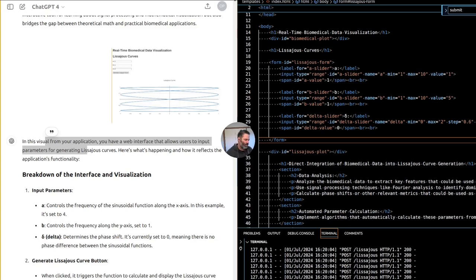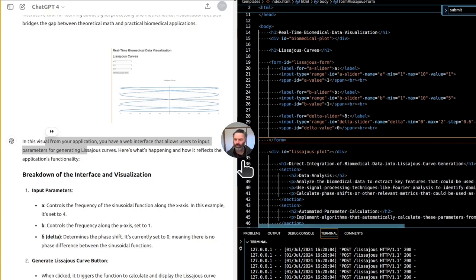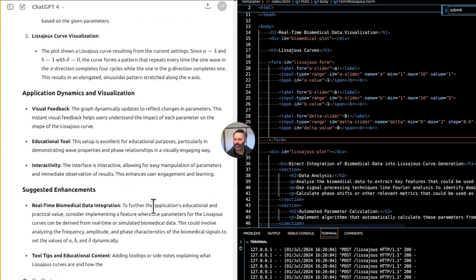Generate Lissajous Curve button. When clicked, it triggers the function to calculate and display the Lissajous curve based on the given parameters.